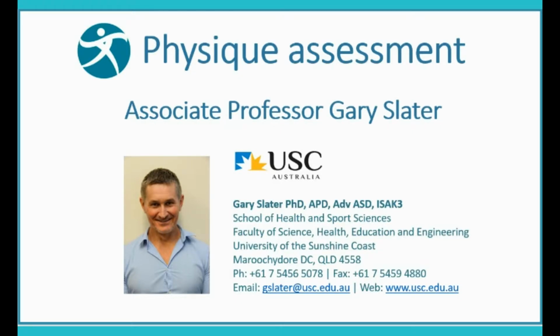Associate Professor Gary Slater. Ultrasound is a technique that really allows us to directly assess at a particular region of the body the subcutaneous fat, or the fat that's just beneath the skin, as well as through to the muscle and the bone. And this provides real insight in regards to composition at that level.